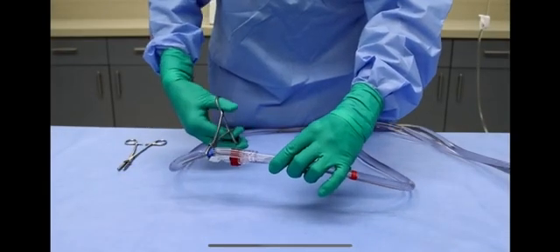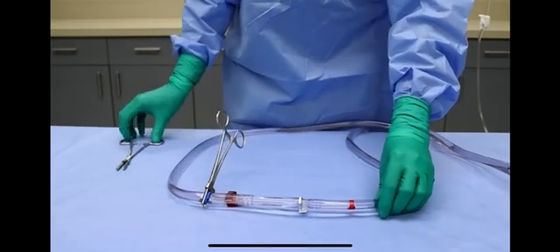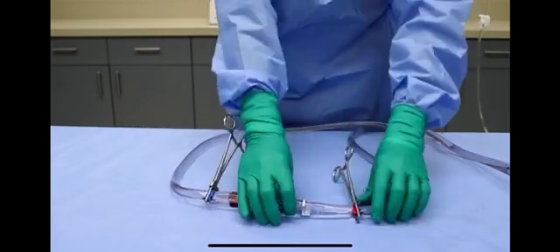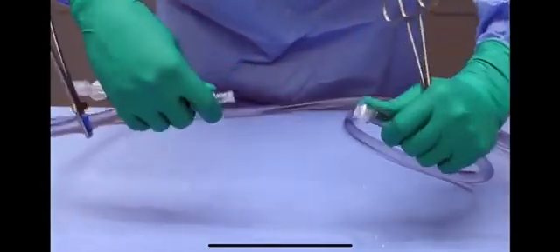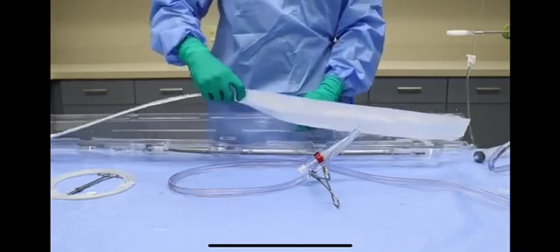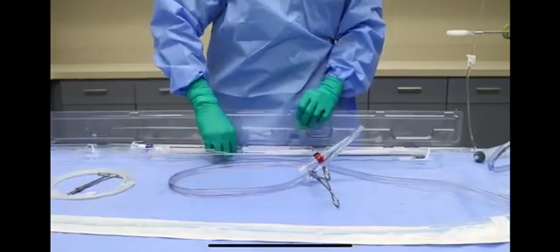Place a clamp on the blue line. Place a second clamp on the red line. Separate the Y adapter from the reinfusion side of the circuit by pressing the white tab on the Quick Connect. Remove the obturator and Angio-Vac cannula from its packaging and place on the sterile field.